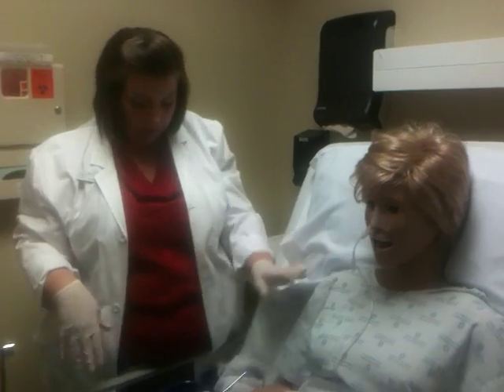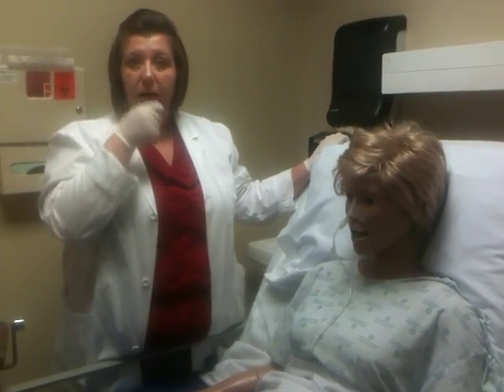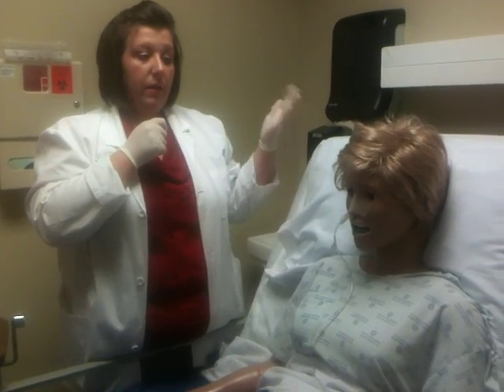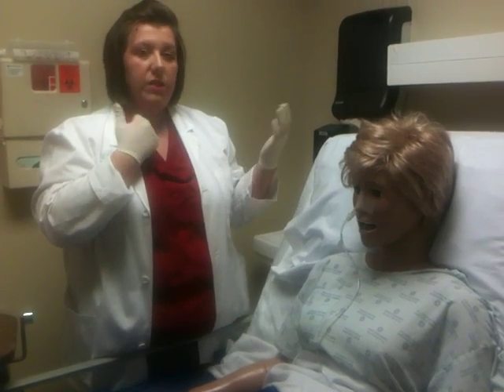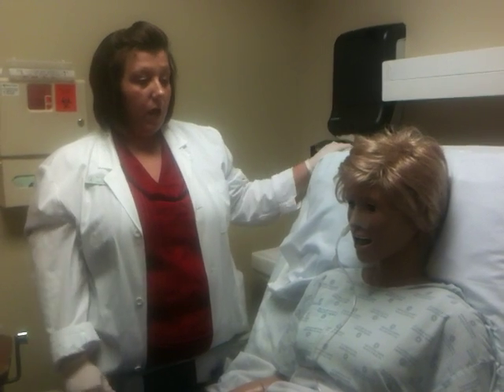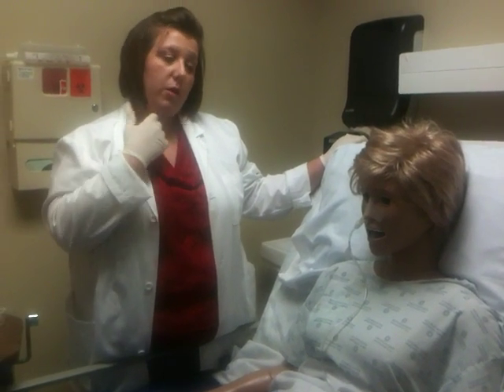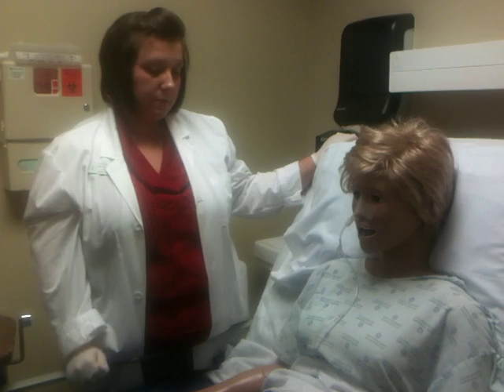All right, Miss Smith, are you doing okay? She says she's doing okay. So if she had started waving her hand at me and told me she was in respiratory distress, then I would pull the tube out slightly and try to give her some time to recuperate, and then I would try to reattempt to insert it. If she still had trouble, then you would just take it out and begin again. If you have trouble going into one naris and you have resistance, then you would want to try the other naris. You wouldn't want to keep trying to push against resistance.